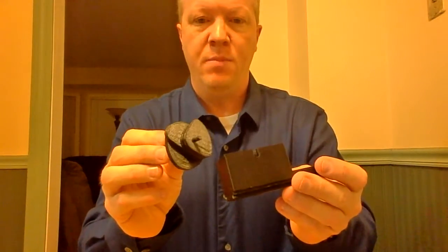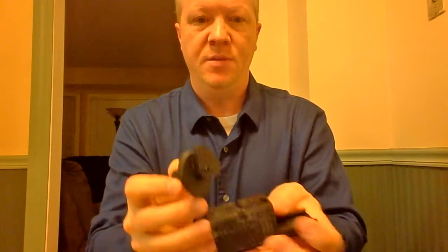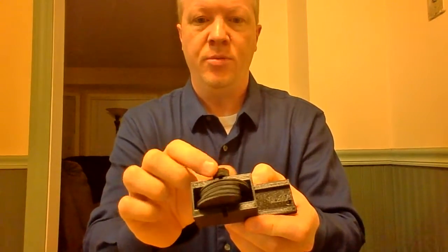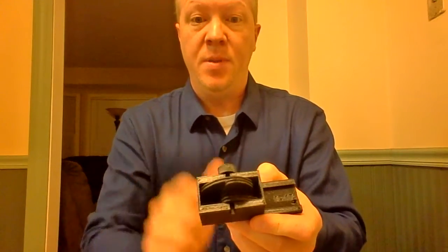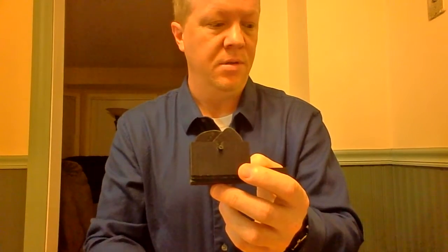Hello. Well, I've been working on my variable hand grip box for the e-NABLE hands, and this is the version one that I had posted a video on a couple weeks ago. It has a rotating cam, different cams. It fits into the box, and then your strings run through this. And depending on what position you've got the cam in, it gives the hand different grips.